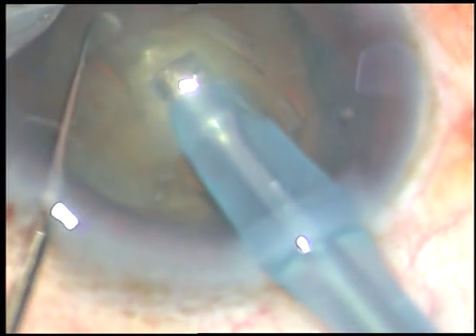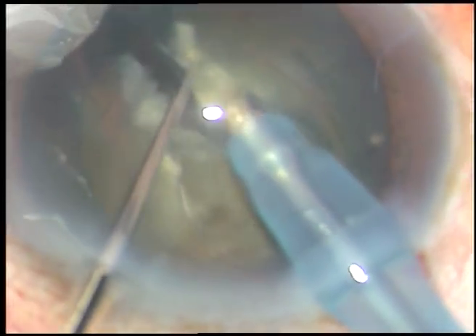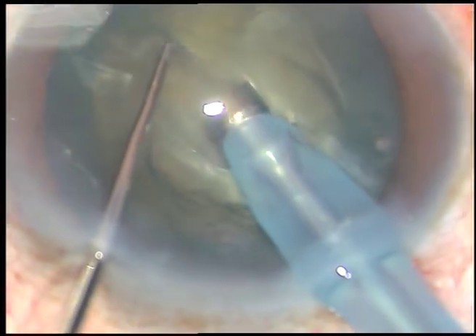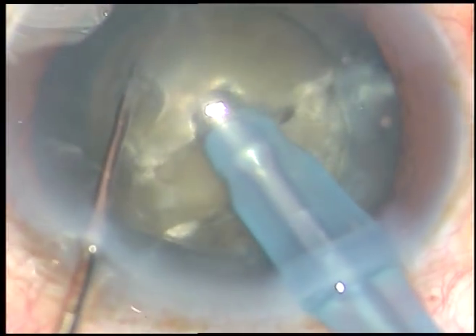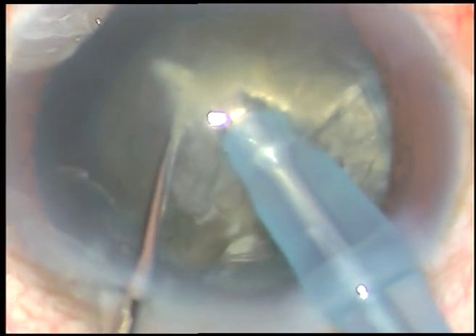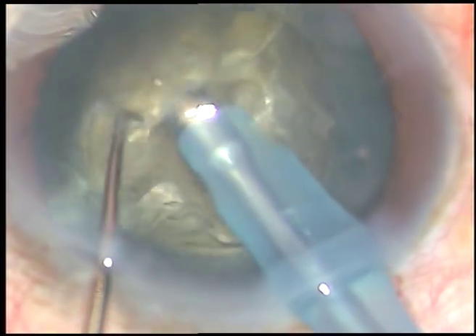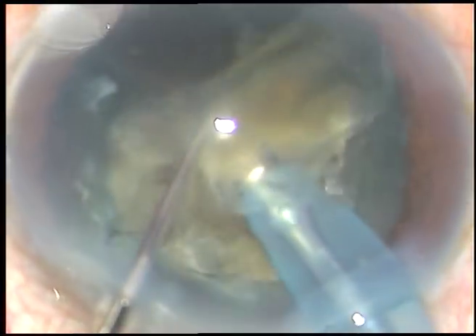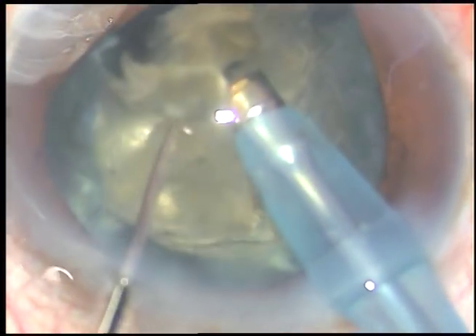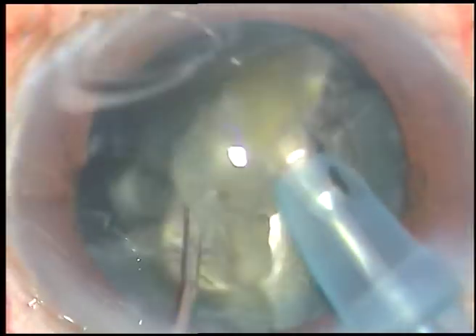This is direct chop — the tip is buried into the substance of the nucleus, the nucleus is held firmly and it is chopped. The nucleus is being rotated 180 degrees and has been divided into two halves. This nucleus is a little on the harder side — about grade 3 plus or grade 4. In softer grade 3 nuclei it is not so difficult to chop.